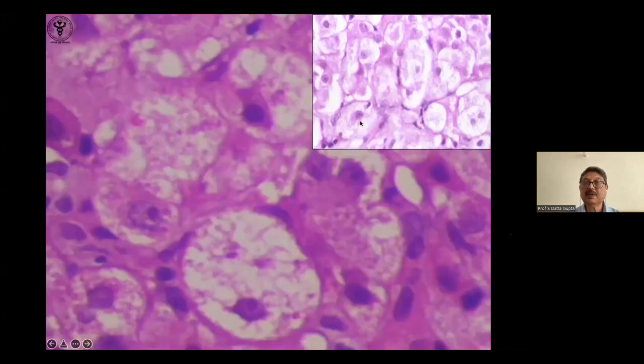Let us go. This is ballooning degeneration. In ballooning degeneration, the sodium potassium pump is affected, like in most injuries, so there's a lot of fluid inside, the cell becomes large, and the sinusoids get compressed. In fact, a lot of ballooning degeneration can compress the canaliculi and cause some amount of canalicular cholestasis and account for some of the jaundice that you get in acute hepatitis.